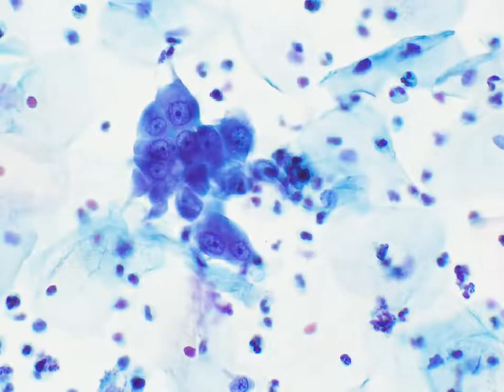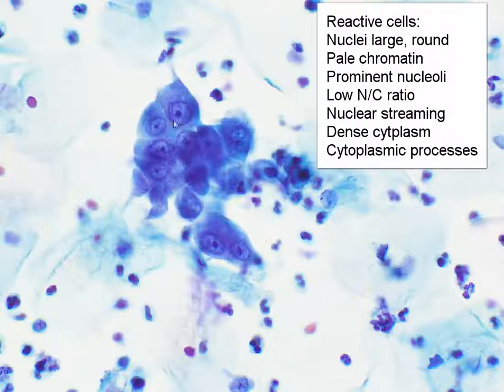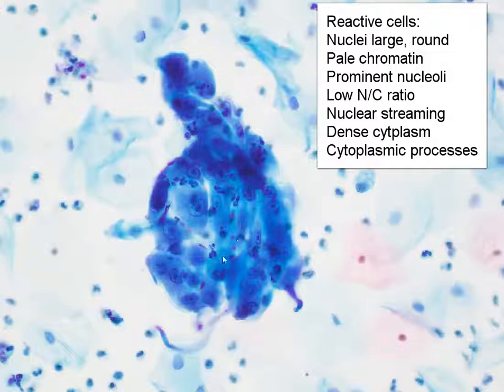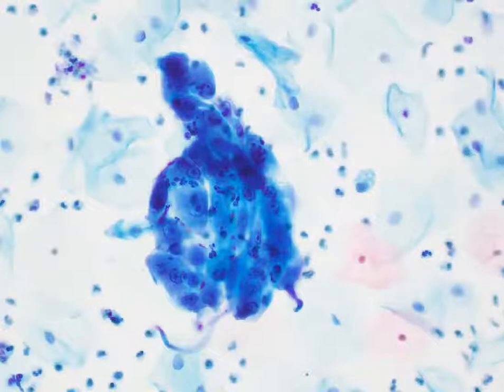This is quite characteristically seen in repair or reactive cells. To summarize the features we can see in reactive cells: large nuclei, usually fairly open chromatin, prominent nucleoli, relatively low NC ratios. Sometimes we can see streaming of the nuclei, which appear to go in one direction. The cytoplasm is usually fairly dense, and occasionally we can also see inflammatory cells admixed with these cell groups. So this is a non-neoplastic cause of hyperchromatic crowded groups.